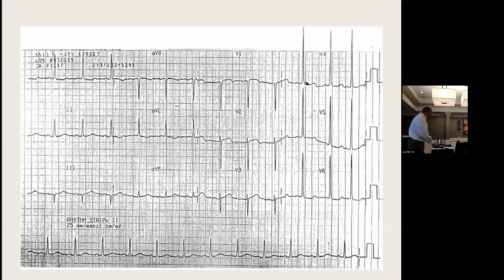So if you can remember, now there are other criteria, and you can look at the R wave in aVL greater than 12. You can look at the R in I added to the S in III greater than 25. You can look at left axis, left atrial abnormality or left axis deviation. Those are additional criteria. But if you can remember 35 and strain in patient age greater than 35, you've done something, and that's good.